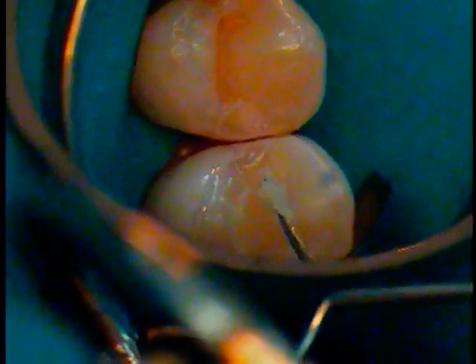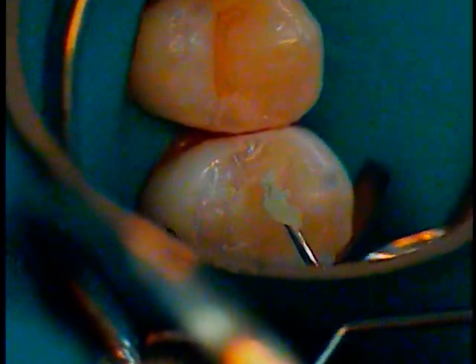I've gotten used to using carbide finishing burrs, which are recommended by the company. They're special gold burrs that are made for finishing composites. Studies have been done under electron micrograph that show a nice polishability versus using a diamond. So we'll stick to that. I'm going to use actually a new one, so we get a nice new gold burr on there.